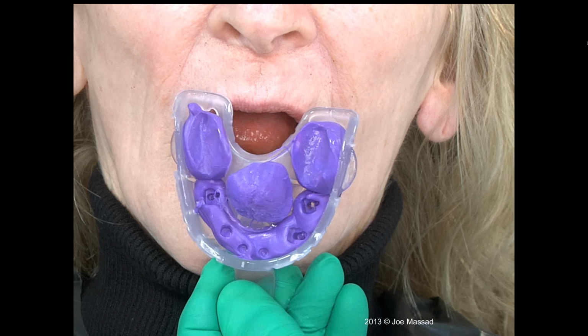In some cases, if it was a fixed case, I could do borders and wash at the same time. In this particular patient situation, we're going to actually make her a bar and an overdenture, and the reason for that is to fill the face. And if we did a fixed case, we wouldn't be able to fill the inside to help support the facial mask on the outside.